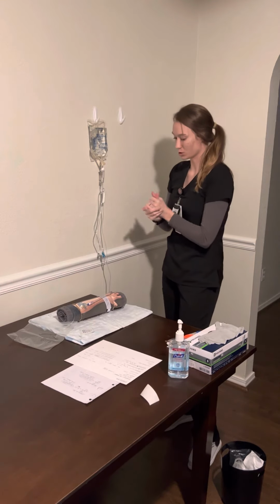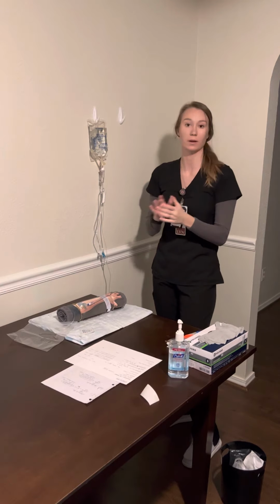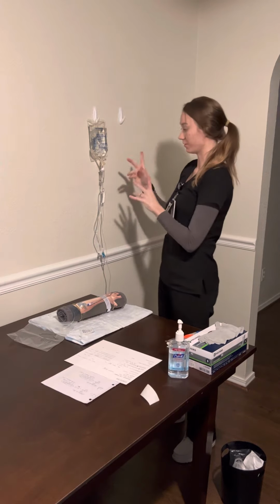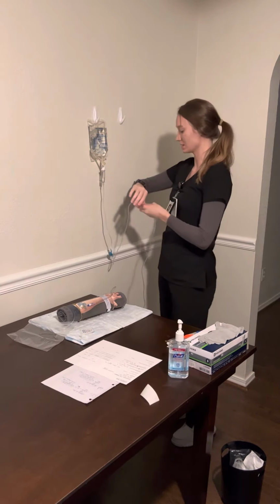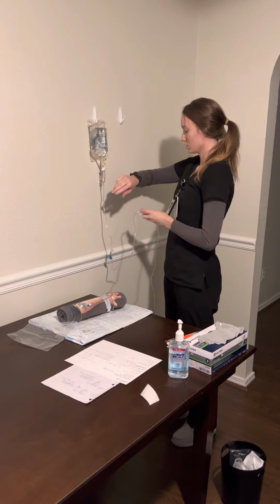And then we're going to open the fluid and count out my drip rate. So again, I need 31 drops per minute because of my 15 drop factor. So we're going to open, guesstimating about 5 drops every 10 seconds, and count this out. So we're gonna start now.